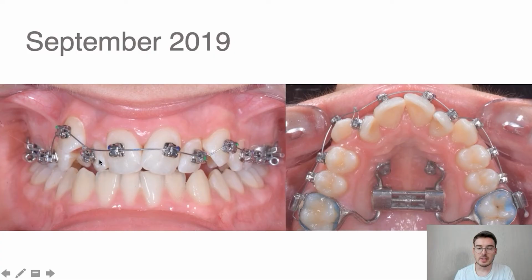Our patient was given professional hygiene for the 2nd time. At this stage, please note that we have just put the braces on. I installed them directly and the patient came back without diastema. It closed by itself in just 2 weeks. Teenagers usually don't need to close it, because there is a crowd in there and then it straightens very quickly on its own. We have put the braces on.